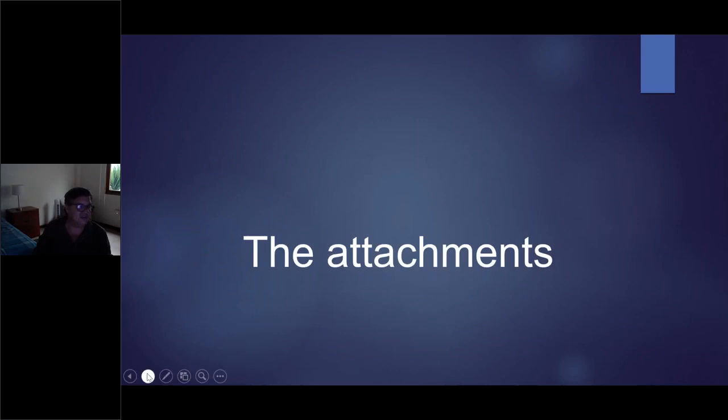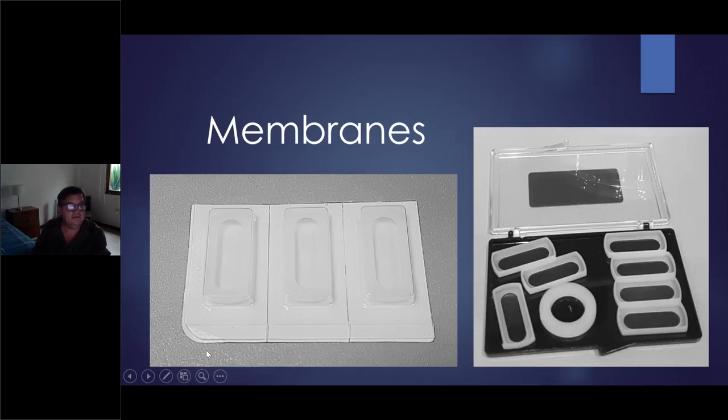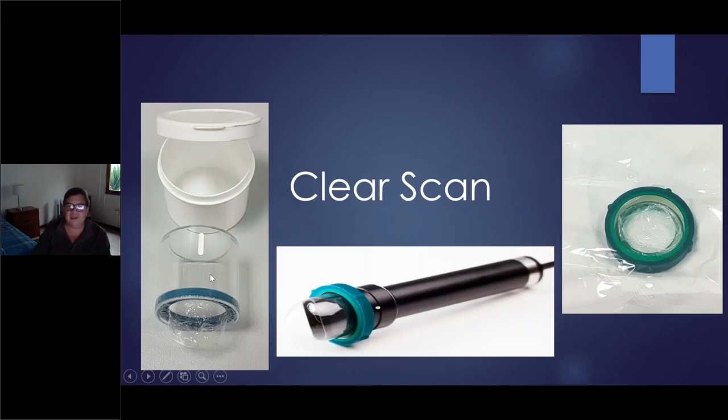There are a lot of attachments, here and here. Distilled water for contacting the eye, if I want to fill the 50 megahertz probe, membranes, scleral shells, silicone that I like very much, and also the speculum. You can use the speculum also. And you have the ClearScan. In the very beginning, the ClearScan looked like this. I have some of them at home, at the office, just to remind me that everything changed. Now we have this ring, this very elastic ring, and this is the new ClearScan.